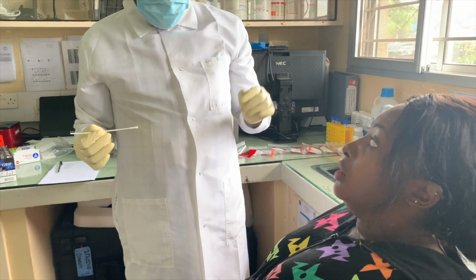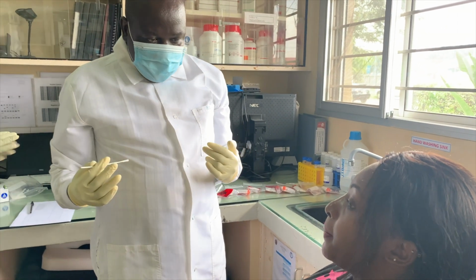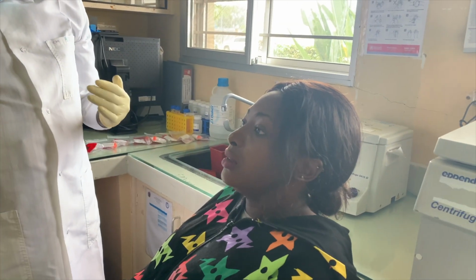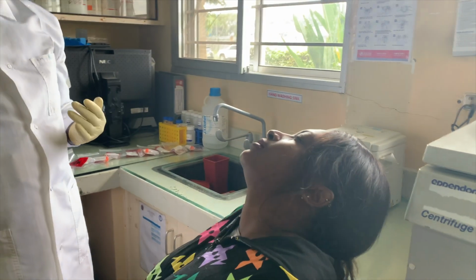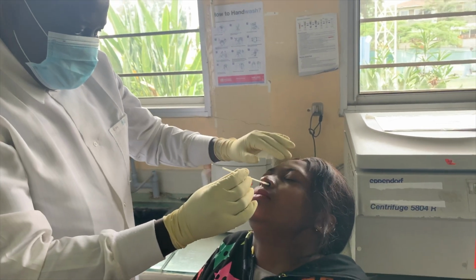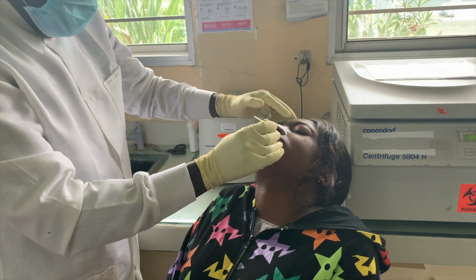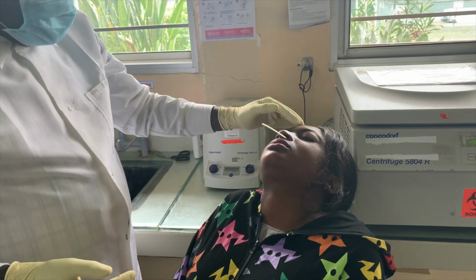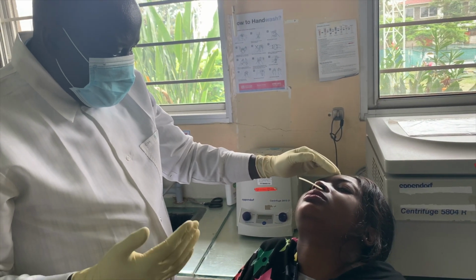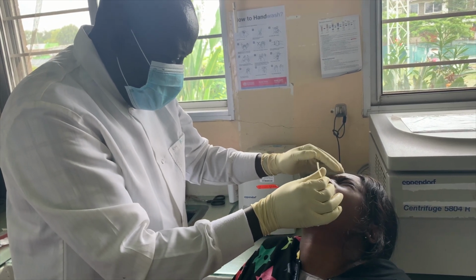So I want to take a nasal swab. Do you want me to do it on the left or right? Can you slide the tip, your hand backwards? Don't pull my hand, please. Careful. Just sit down there. Is there any pain? 1, 2, 3, 4, 5. Now take it down like so. And I'm through.